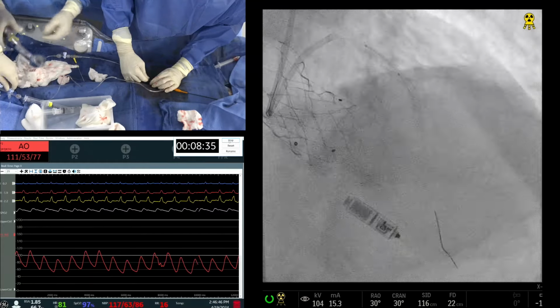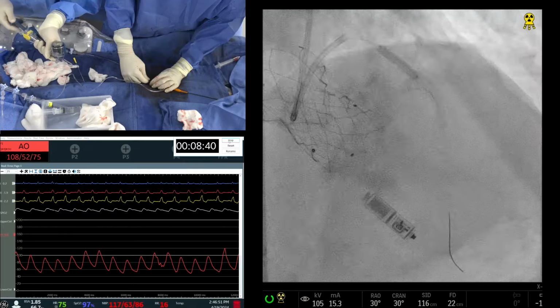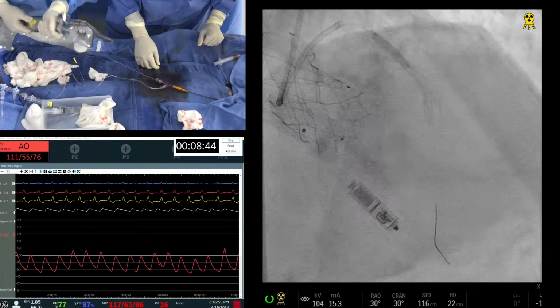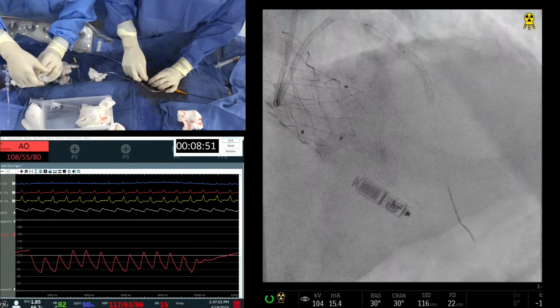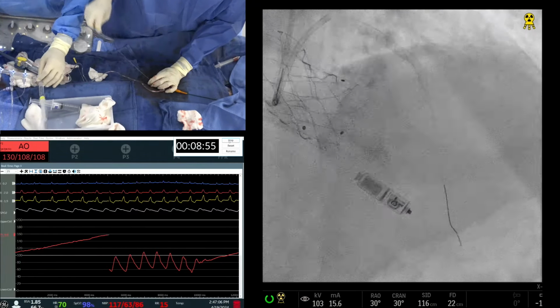Okay, go up here. Proximal edge, yeah. Now you got 20 there. 20, yeah. IVUS is ready. Final. And we got 3-4 minutes. We'll be on time. Yeah, I think you guys are doing great.